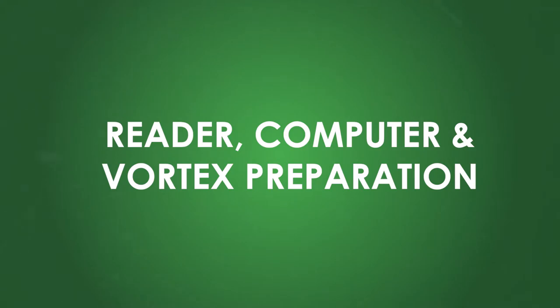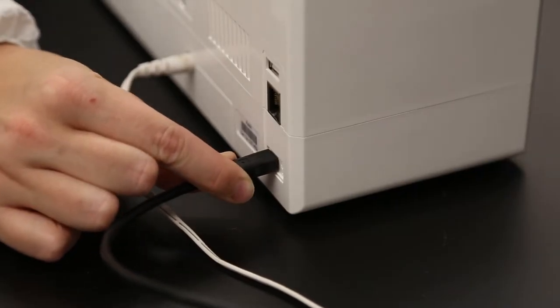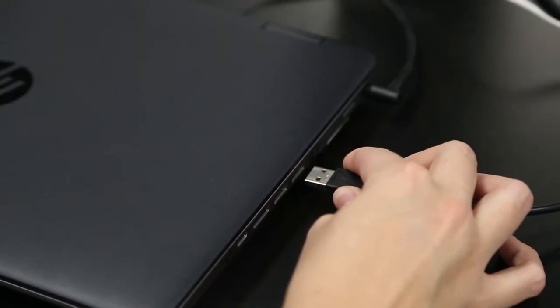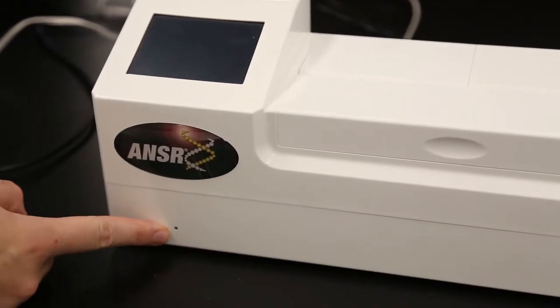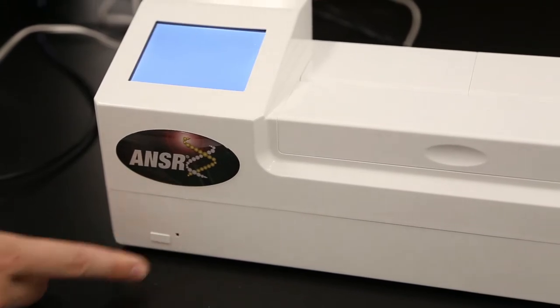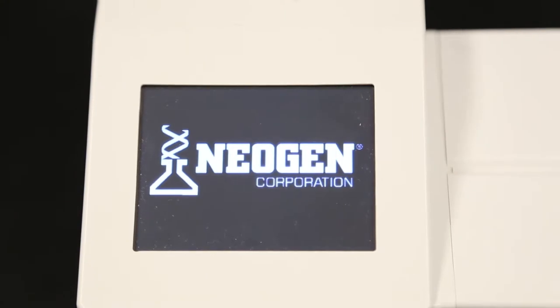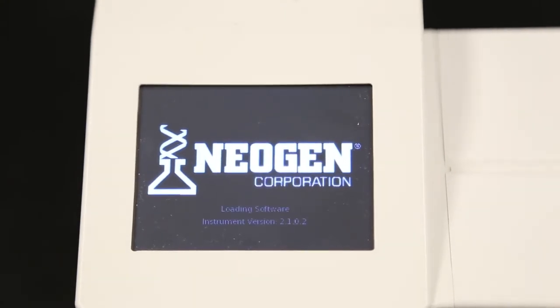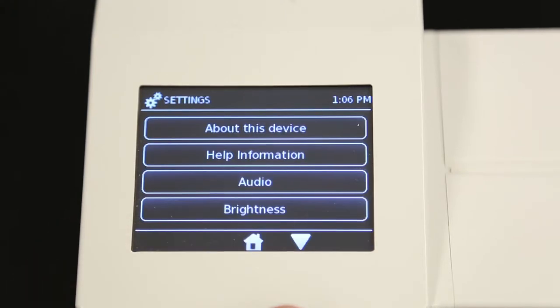Reader, computer, and vortex preparation. Make sure the answer reader and provided laptop are plugged in, and the connector between the reader and laptop is secure. Turn on the answer unit by holding the button on the front just for a moment. It takes the unit about a minute to load the software for use. The first time you use the reader, you need to select the third box on the touch display with the gears. Then, press the down arrow once at the bottom of the screen.